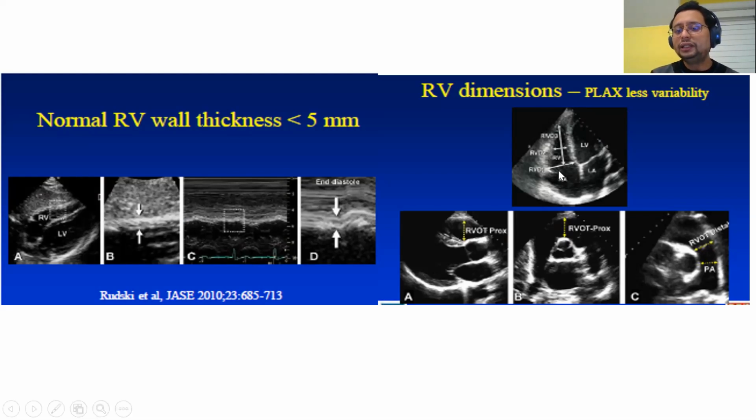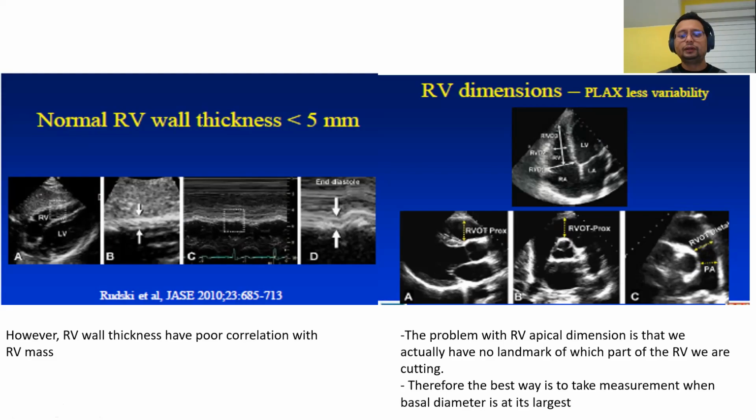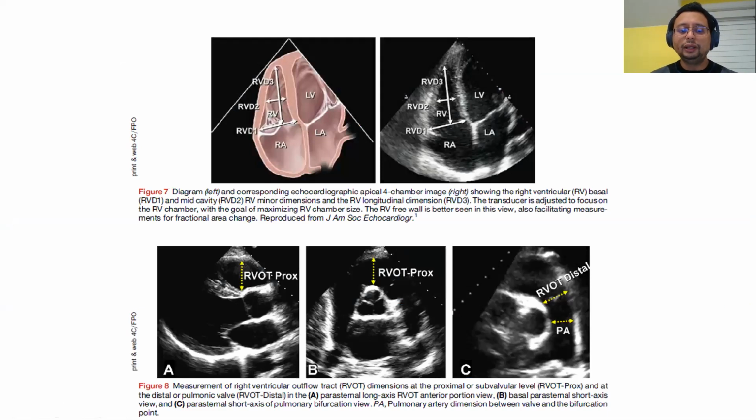So this is the dimension here. I asked you to remember already just now what is what. So this is 4.1, this is 3.3, and that is 2.7 there. So remember that. All right, one more time to show you where we measure. If you want to take a look at that.